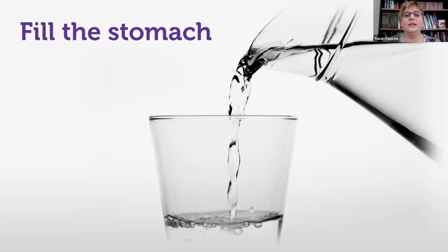But what you can do is roll the patient onto their right side so that the gas moves up and out of the way. And the theory here is that if there's fluid in the stomach, you distend the stomach, you have a nice black, like how the bladder works for the uterus. You have this fluid-filled stomach that helps act as an acoustic window for the pancreas.